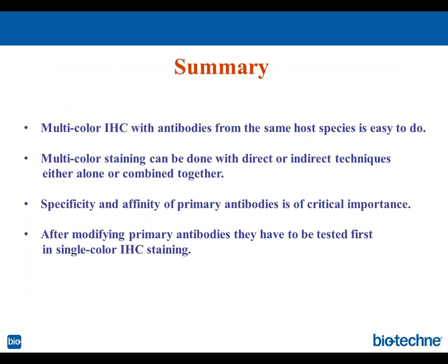We have a question about autofluorescence as well. Is there a way of reducing background autofluorescence on your tissues? It depends on what the autofluorescence is, where it's coming from. There are endogenous substances which autofluoresce, and it's really hard to quench their autofluorescence. A good example would be so-called lipofuscin. That's the aging pigment stored in lysosomes, which fluoresces under different filters and gives us red, green, blue, all sorts of fluorescence.